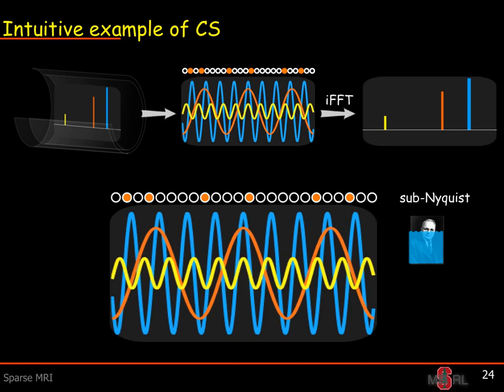Okay, but now let's say that we sample randomly, right? So we space our samples randomly in time. What we're going to get then is incoherent aliasing that looks more like noise. Now, that doesn't mean that some of the features are still not going to be sort of underwater here, right? That is, you will definitely have features that are underneath the aliasing of other features.